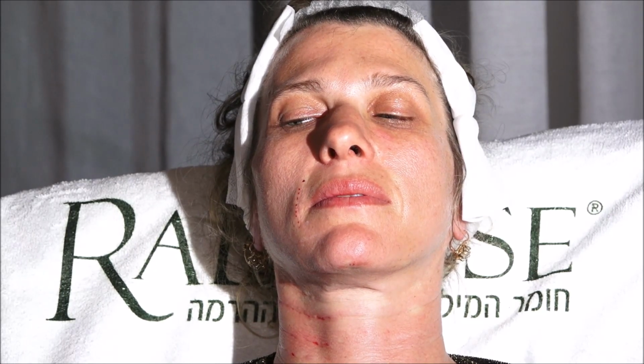Okay, now let's talk toxin. I have a flight in a few hours. Thank you. I didn't know. Oh, we can. Dilution to 1. Yes, give me 25 units.